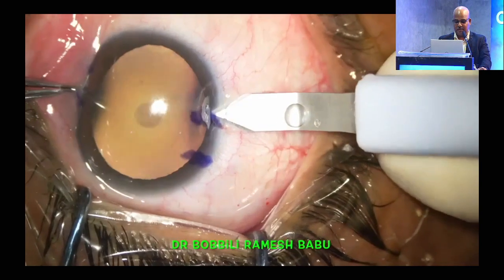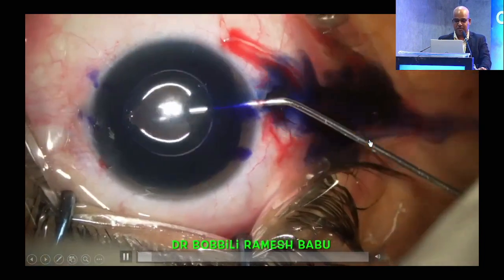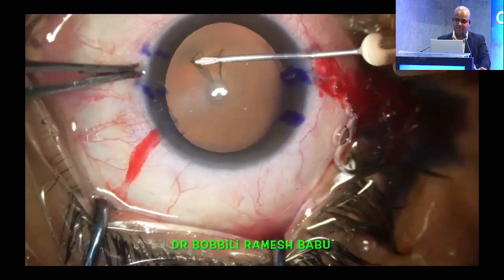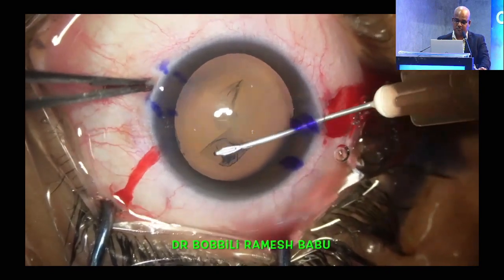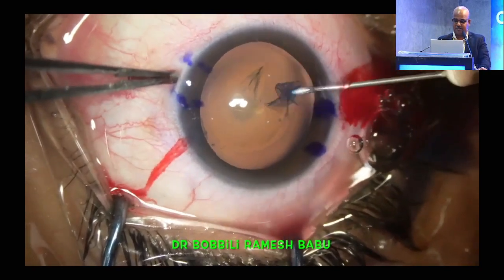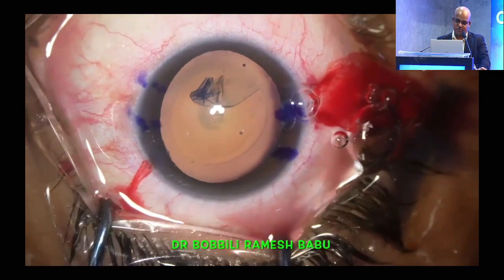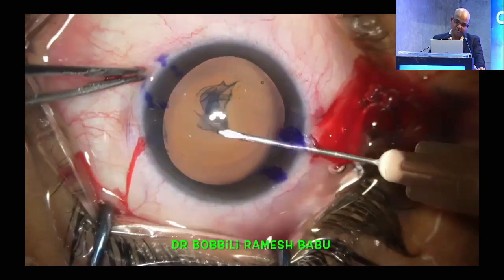This is a high-Q toric lens. Horizontally, I am making an incision. The side port is made, then the capsule is stained with trypan blue. The chamber is filled with viscoelastic. Now capsular access is being done with a bent 26 needle. I usually aim for a 5 to 5.5 mm rhexis in all toric cases. Because of the viscoelastic, there was a tendency for the rhexis to extend to the periphery. In these lenses, especially torics and multifocals, the rhexis should not run away.